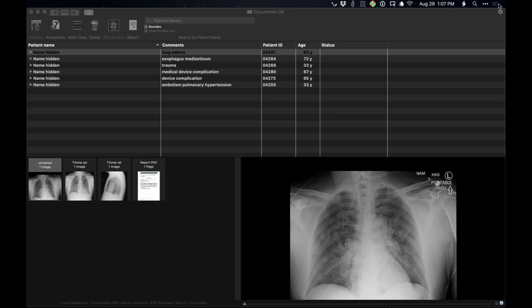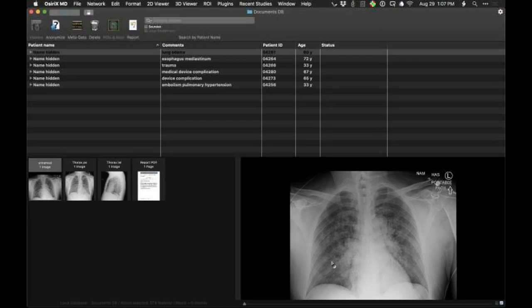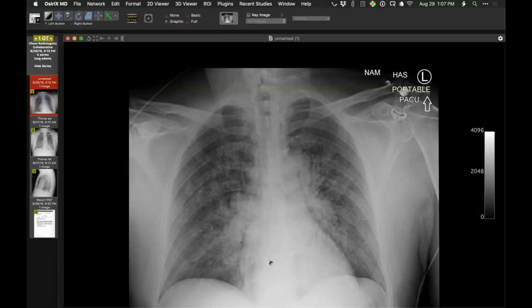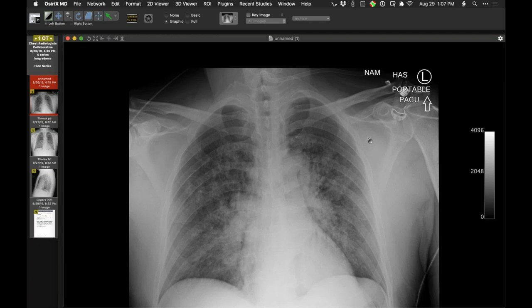Let me start off with this case. We've seen this before, but it's a nice example. When interpreting a radiograph like this, you can't really come up with a reasonable guess at the diagnosis without clinical context. Here's a hint: post-anesthesia care unit. And this is a really nice example of acute airway obstruction lung edema.